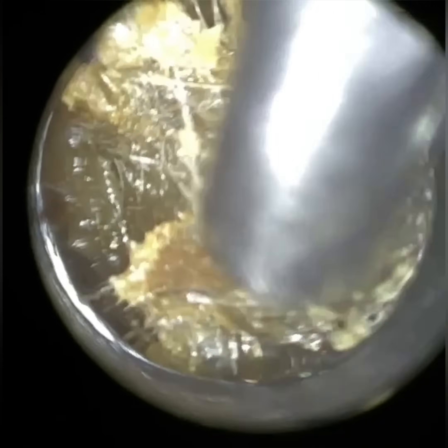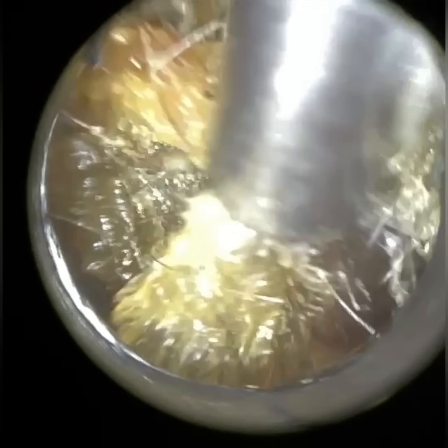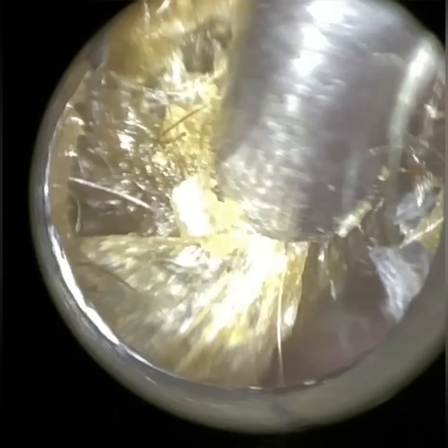We have here a patient who attended with bilateral, fully occluding, matted, sticky earwax and dead skin, as you can see. I'm using our standard speculum size, which is a size 2, with an internal diameter of 4.25mm. It's in keeping with the normal speculi that most audiologists use to examine the ear, at least for adult patients.